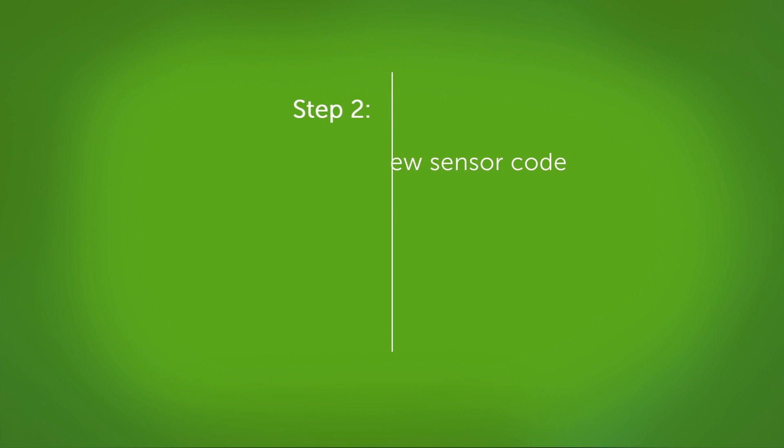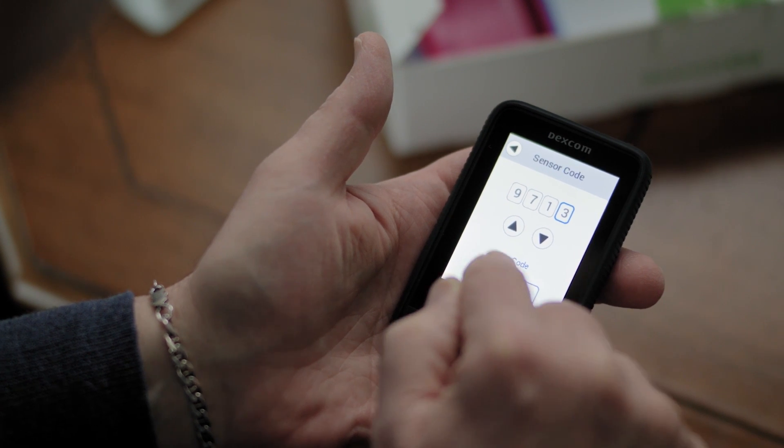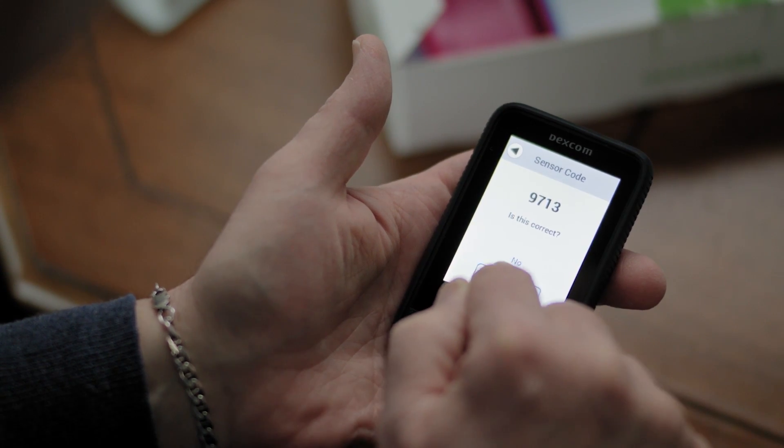Next, you will need to enter a new sensor code. You'll need to enter a new sensor code because the code is specific to each sensor. Grab a new sensor and enter the code.